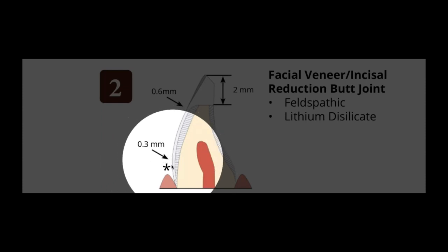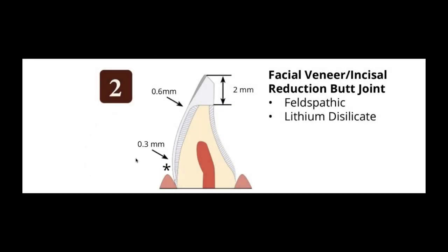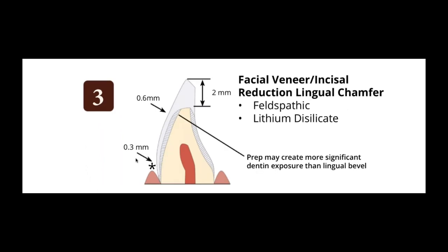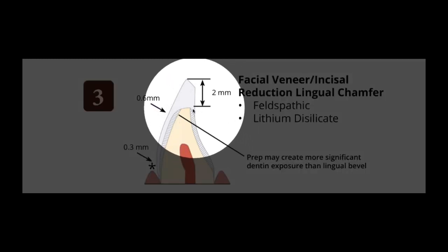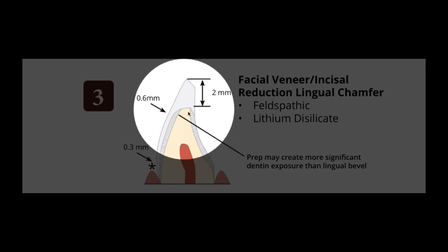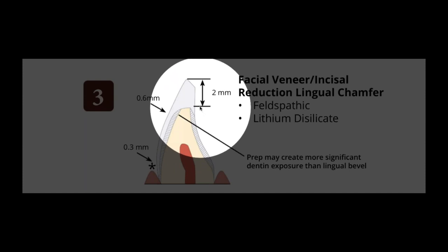These could be more, and it also could be maybe slightly less, depending on, again, coloration and tooth position that you're looking to work through. The other one is where we can actually get more reduction and start to drop over the lingual. But I'm going to be honest and tell you, I don't like this. I don't ever want to see it. And I really highly encourage my doctors not to do this, not to flatten that incisal edge position and then wrap over.